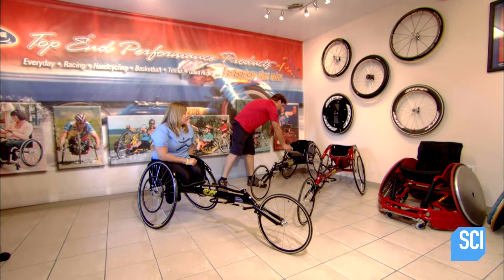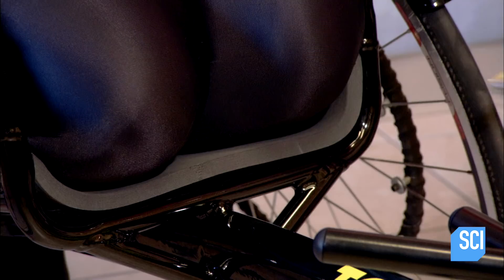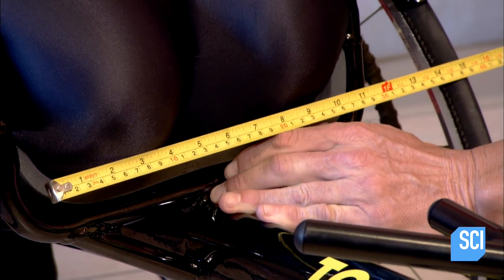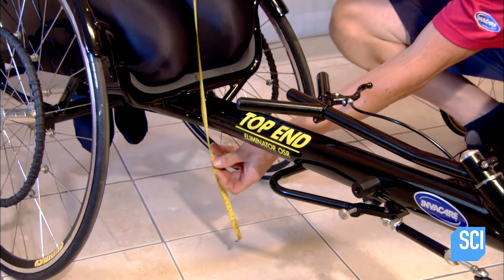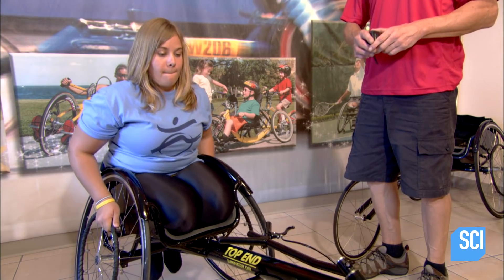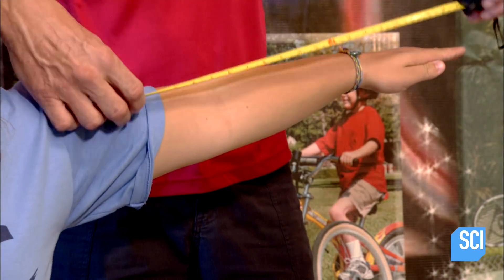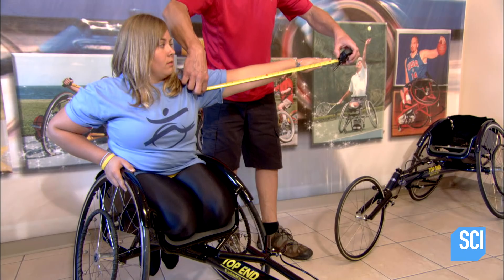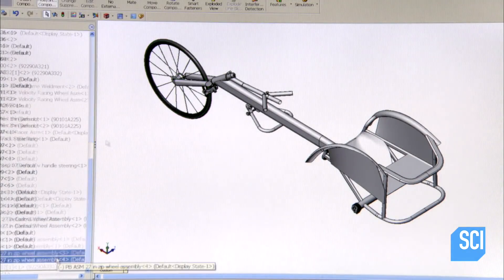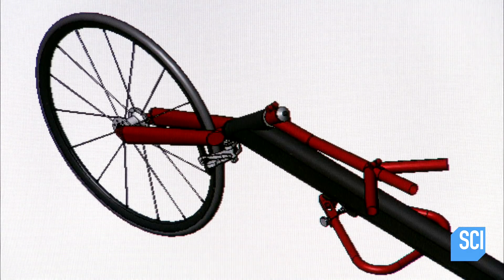They begin by taking detailed measurements of the athlete as she sits in a demo chair. They measure the width and height of her knees to determine the best seating position, check the balance point to decide how the rear wheel axle should be positioned, and measure her arms so push rims can be sized for her. They then produce a digital drawing of the racing wheelchair, complete with any extras requested by the athlete.